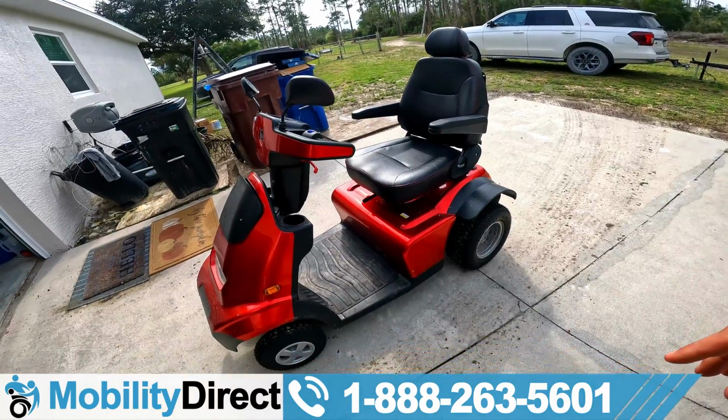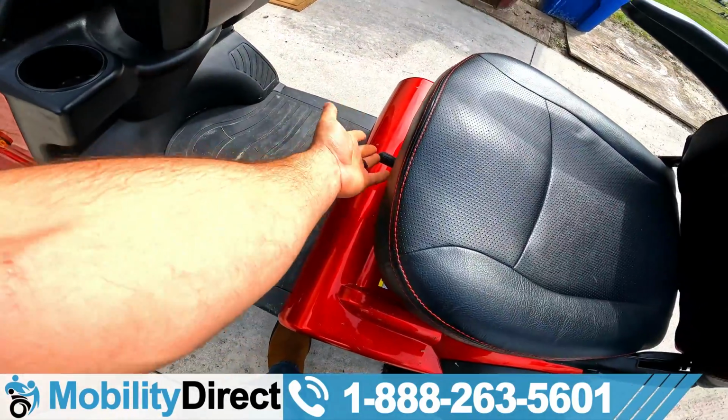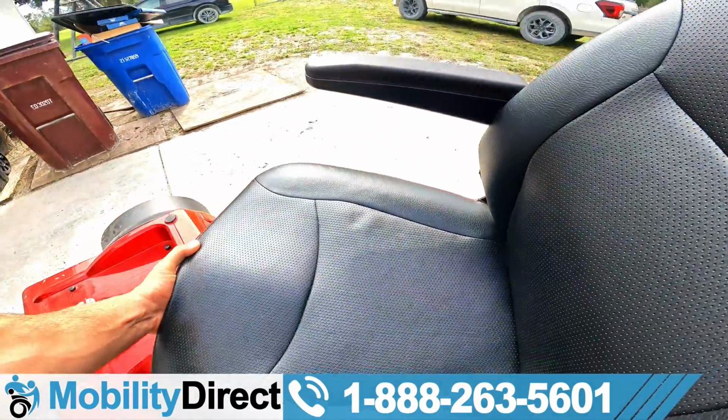All right, folks, so I'm gonna go ahead and take off the seat first. That's the first step you need to do. There's a little lever here on the front of the seat, so you wanna lift that up and hold it up while you're picking straight up on the seat, and that's gonna allow the seat to come right out.